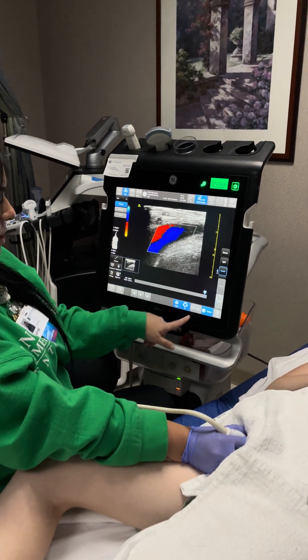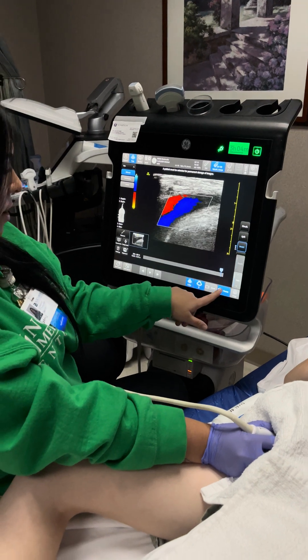If we wanted to store this image, we would just hit store — and our image is saved.